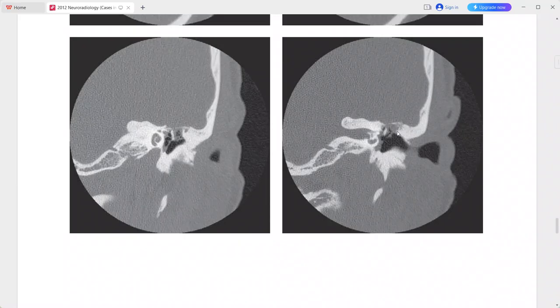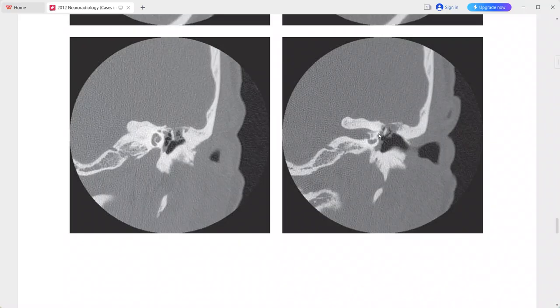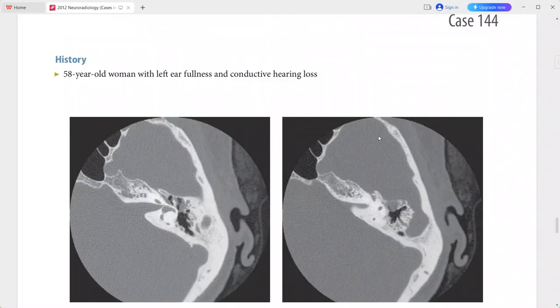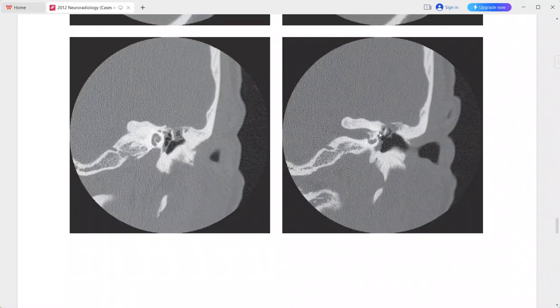There is erosion of the body and short process of the incus along with erosion of the scutum. The tympanic membrane is thickened and retracted, and the ossicles are displaced medially. This is a case of acquired pars flaccida type cholesteatoma. Differentials include chronic otitis media with bone erosion.